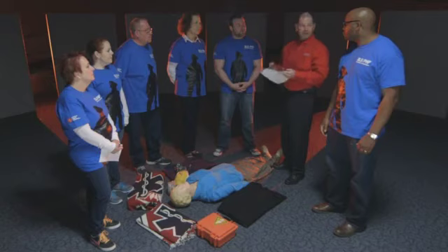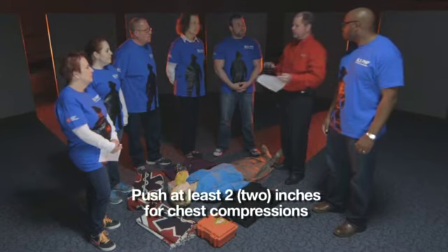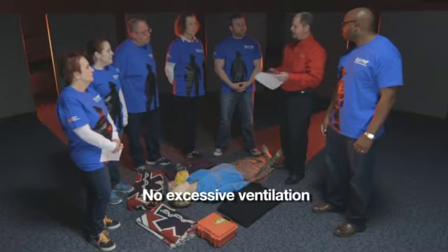Good morning team. During this activity, we want you to practice like you would in a normal scenario in the workplace. Follow your local protocols. The goal is to perform high-performance CPR or high-quality CPR, which is identified as pushing at least two inches on the chest for compressions, at a rate of 100 to 120 compressions per minute, not leaning on the chest, allowing full chest recoil, and not excessively ventilating the patient.